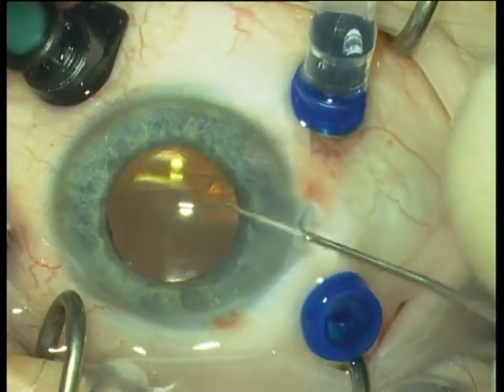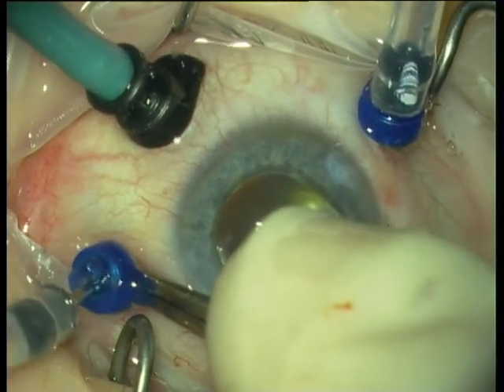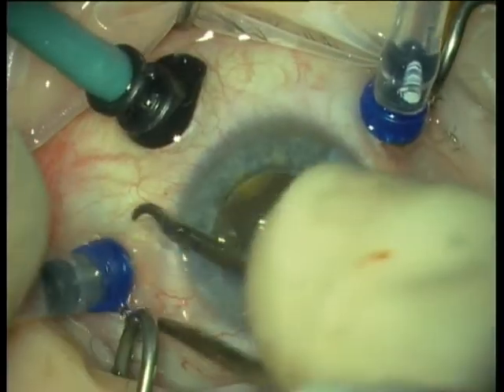The IOL can of course also be implanted in the beginning; we used to implant it later because the edges of the IOL can be disturbing if you work in the periphery. What follows now is a PFCL-against-air exchange. I now introduce the infusion line of the silicone oil infusion and perform an air-against-silicone-oil exchange.